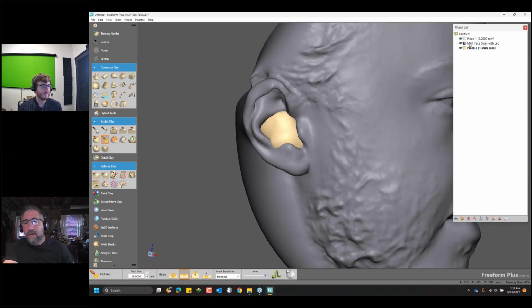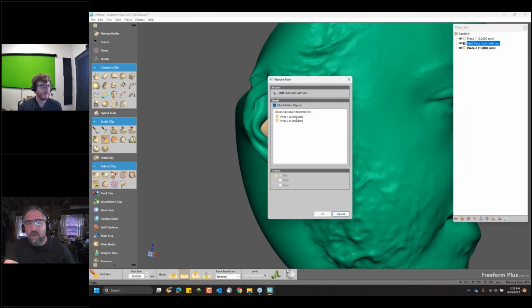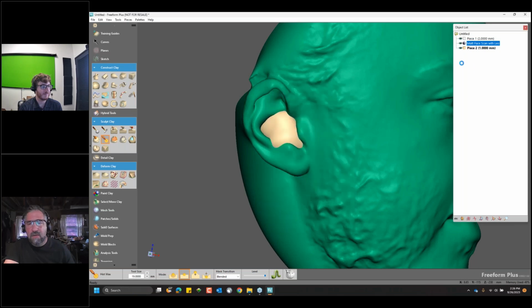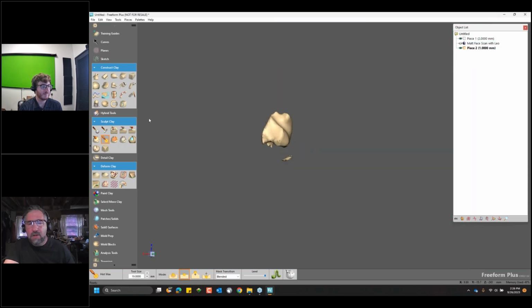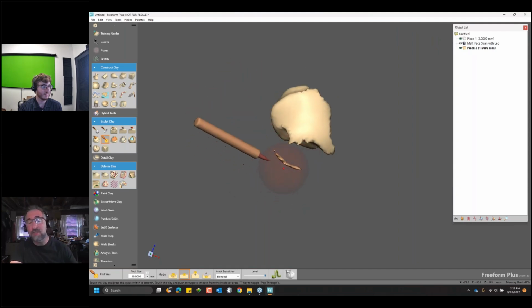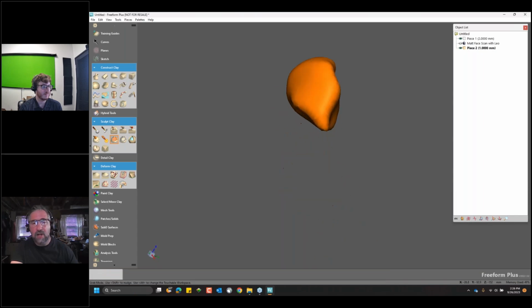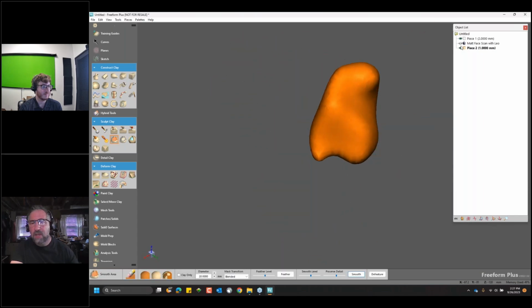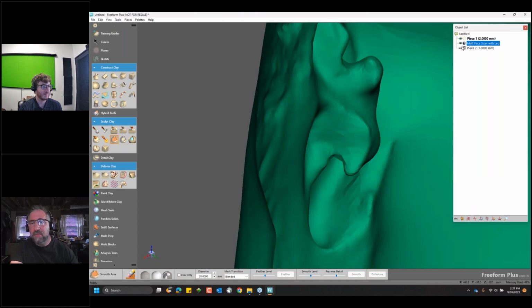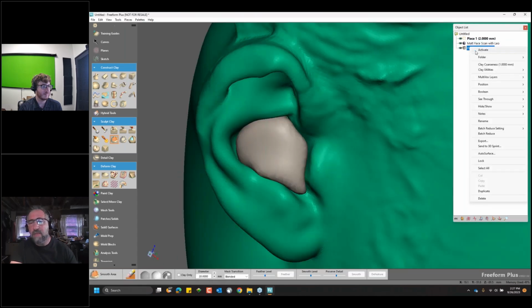And what I need to do now is I'm going to take Matt's head and I'm going to remove it from this piece of clay, leaving us with a representation of the inside of the ear, as well as a small region that was left over and stuck out of the model where I just didn't clean it up very well. But we can smooth this and make this look a lot nicer. And this is an accurate representation of the inside of that ear.